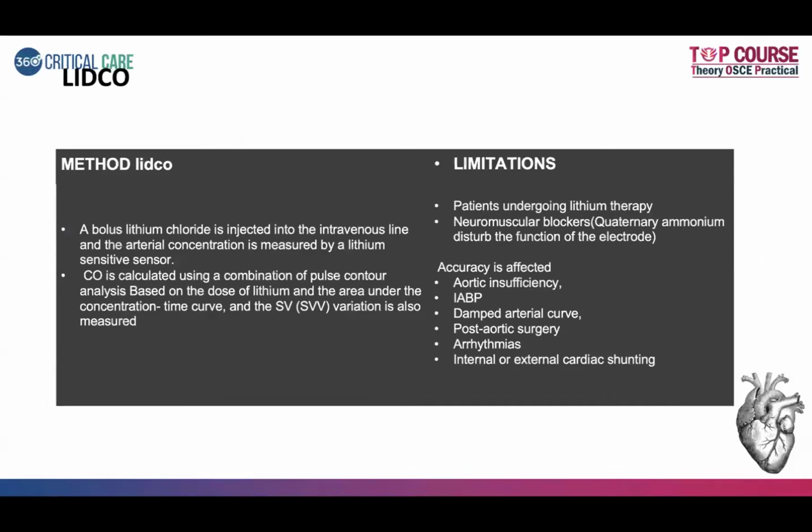LiDCO is one of the common methods which we use. What you are doing in LiDCO is kind of an indicator dye technique. Instead of cold saline, you are using lithium here. That's all. You are injecting the lithium into the venous component, and you are measuring that lithium at the arterial component with a sensitive sensor. So basically it measures the area under the curve and the stroke volume variation.